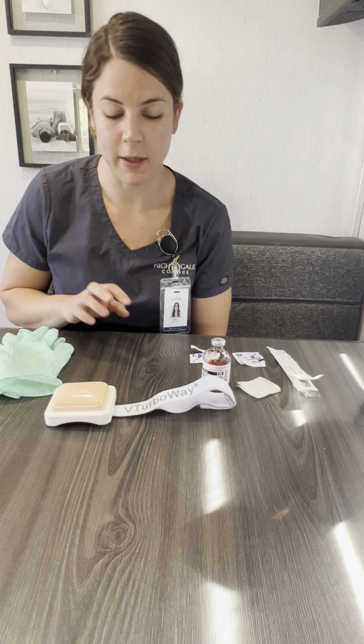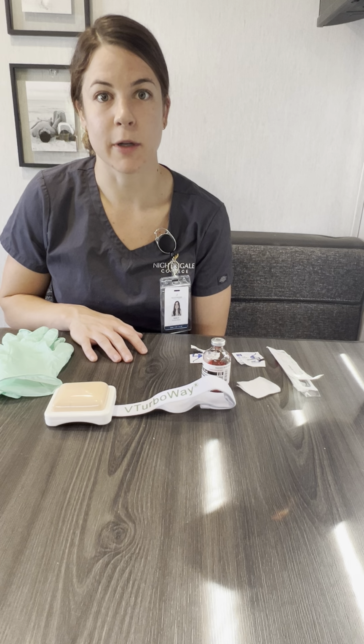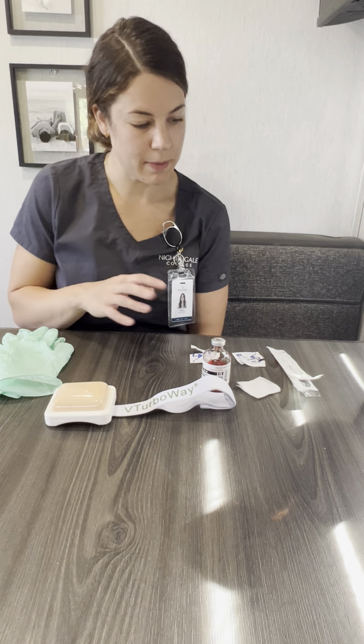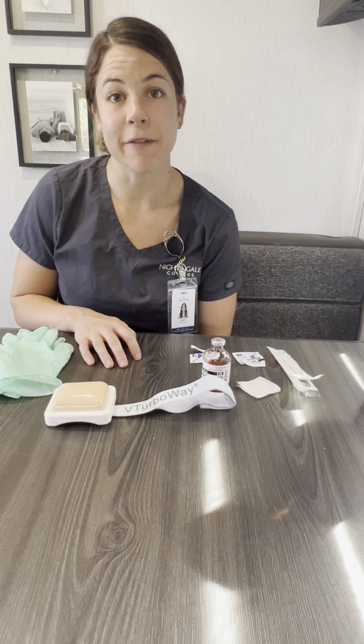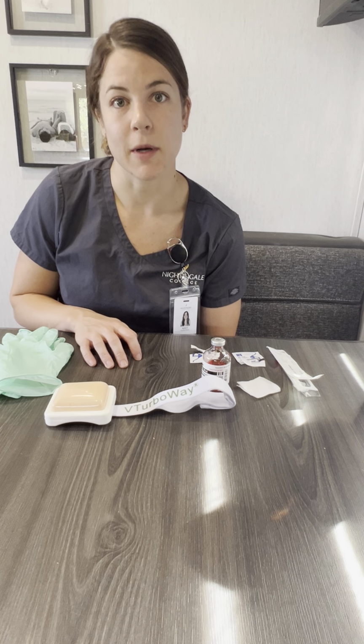I'm going to be performing the skill of administering a tuberculosis skin test and intradermal injection. I have all my supplies gathered. First thing you want to do whenever we are administering medication, we want to verify the orders and we want to check the 6 rights of administering medication.